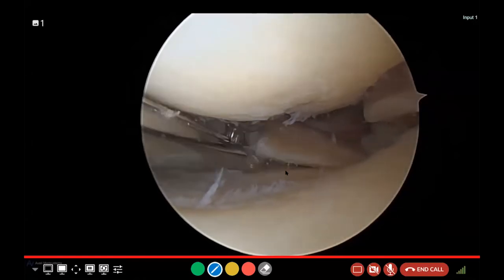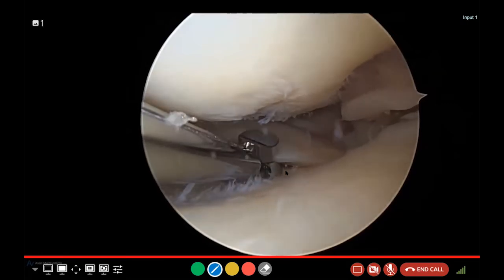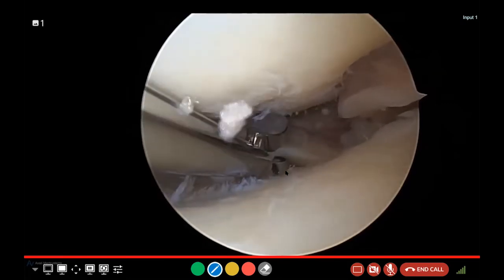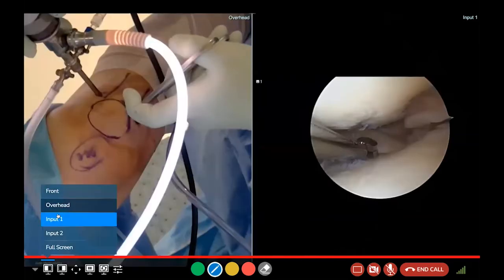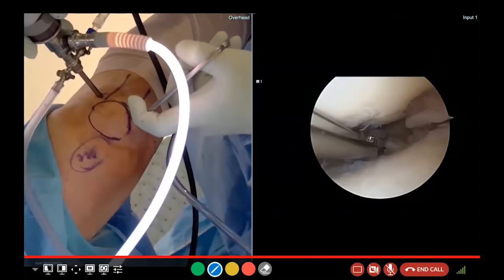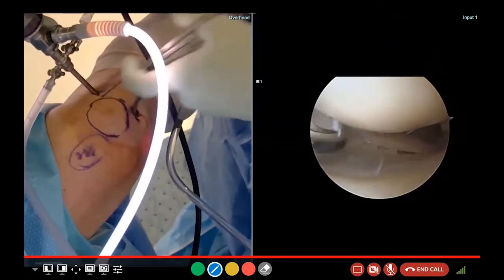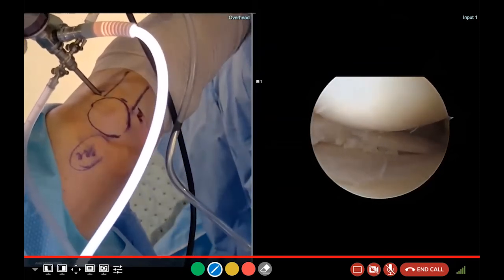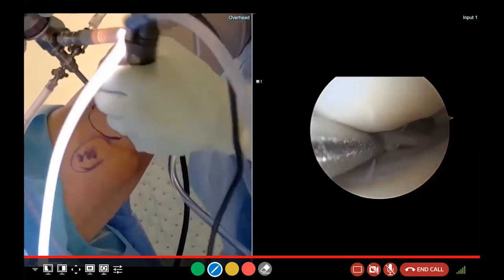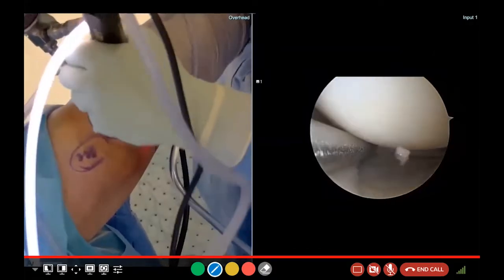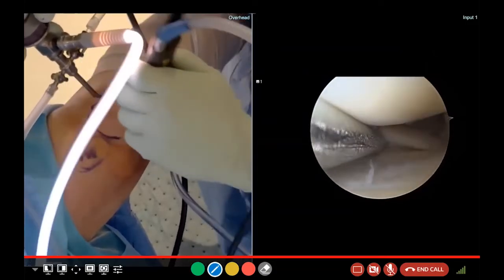The reason I picked this case is the clinical question here — the clinical debate — as quote-unquote simple as this case is: how much can a knee scope help a patient who already has arthritis? Because he has bone-on-bone on the contralateral side, I thought it was worthwhile to debride his meniscus, smooth out the cartilage damage — we call that chondroplasty — and give him the best shot. He actually has no pain in his other knee despite the x-rays showing bone-on-bone.